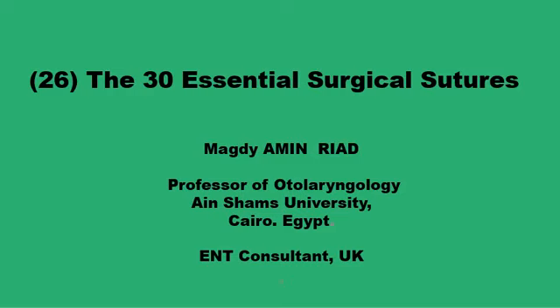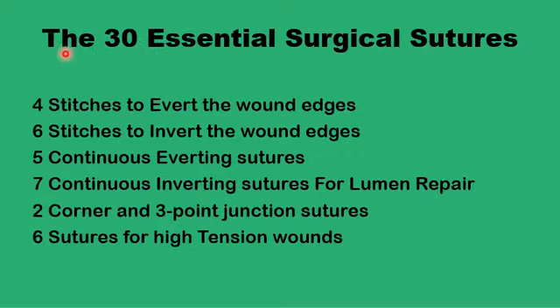We probably use half of them on a regular basis in our everyday surgical activities. But there will be surgical situations in which a good knowledge of the other half would be useful. We'll go through the 30 sutures one by one.